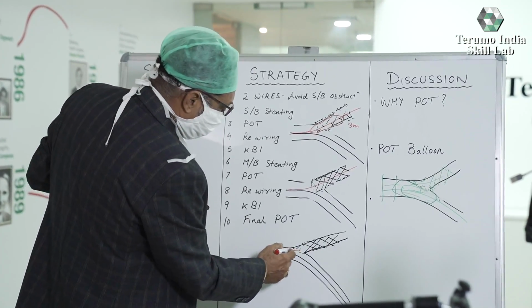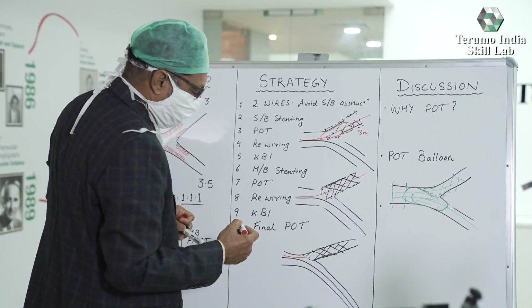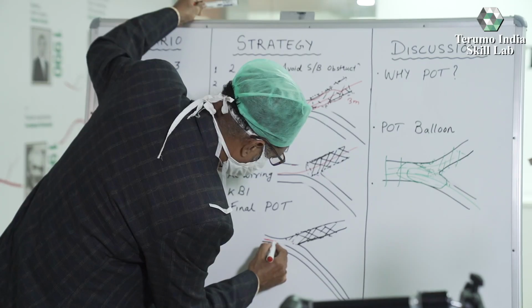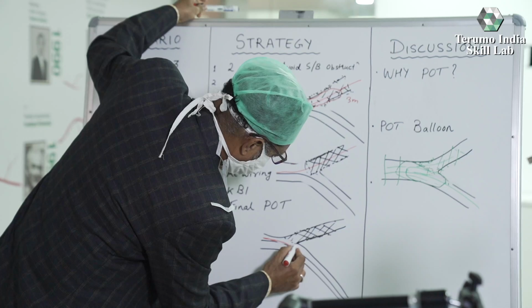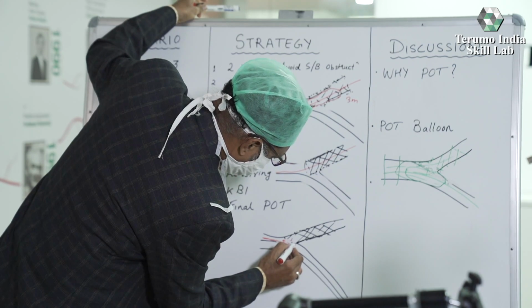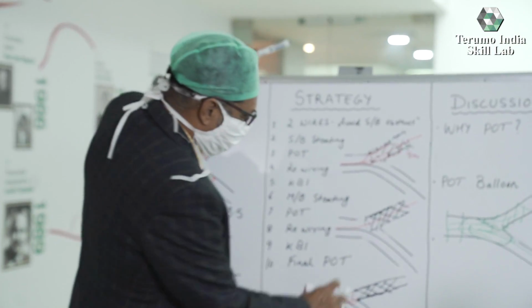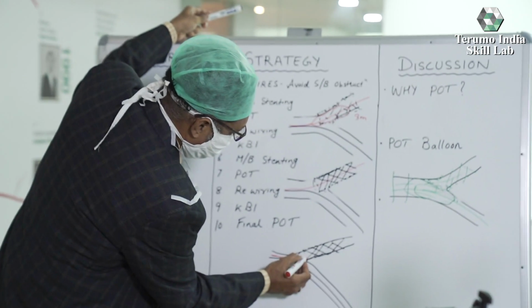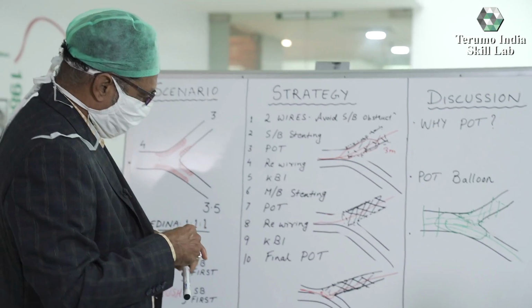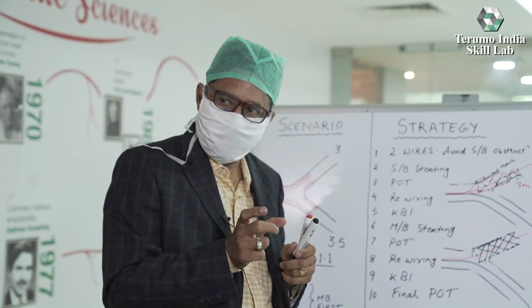When we crush this stent with a balloon, we remove the wire, and then we pull back the wire like this, and then the wire just flopped in from the distal-most track. Okay, so the wire went in. It's a very critical step when you are wiring across a crushed segment.